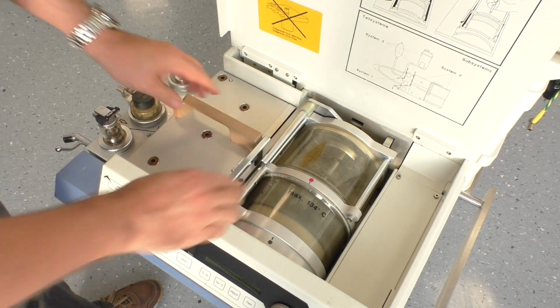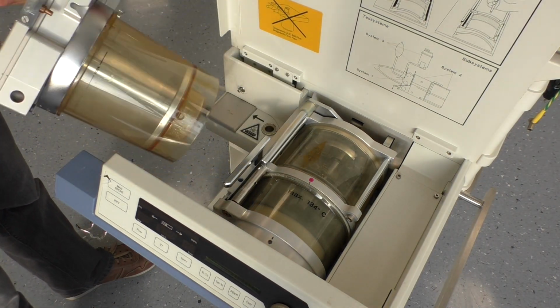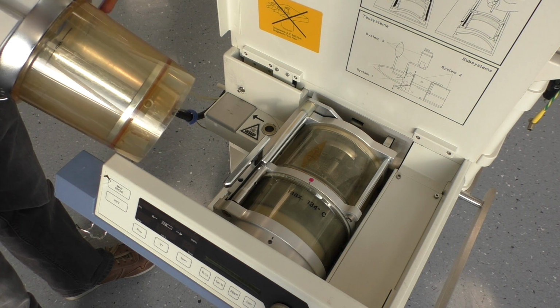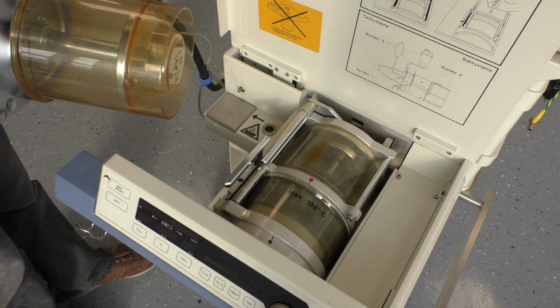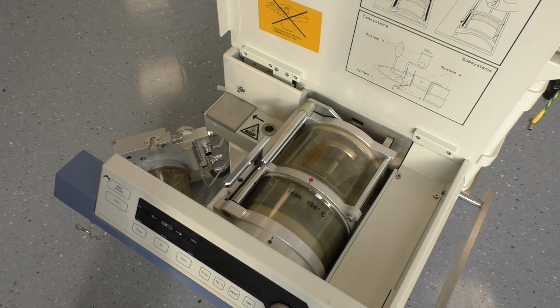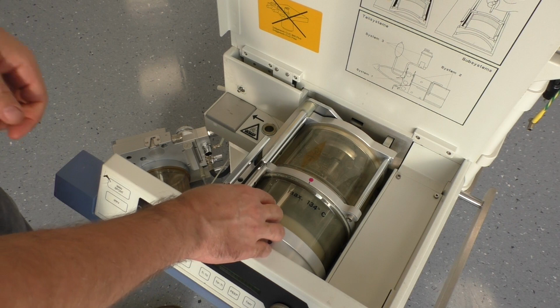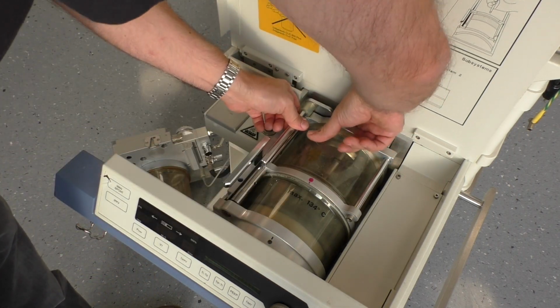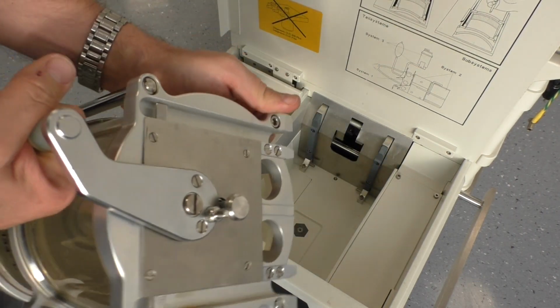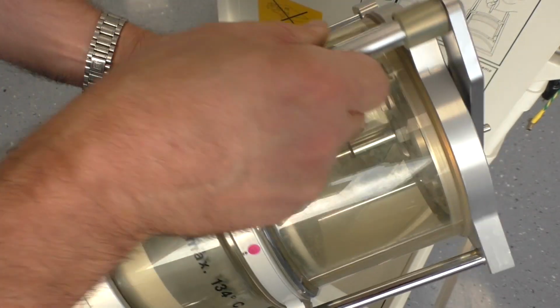First step is opening that lever and removing that part here, which is some sort of filter, maybe a moisture filter unit that removes moisture from the gases here. This is the pump unit. There is a rubber bellows inside here. It's a little bit jammed. It goes out like this. Looks like some part of an atomic bomb or something.